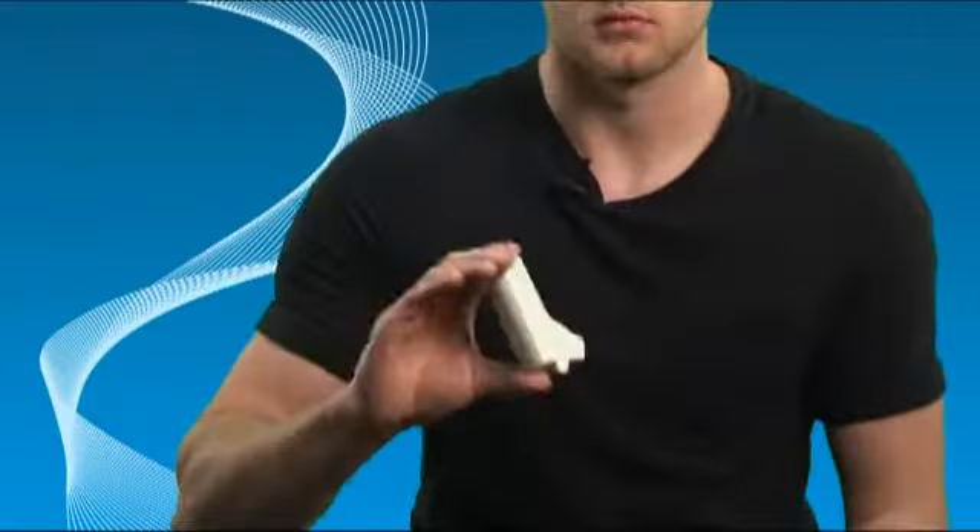How to use the Easy Breathe. Shake the inhaler. Hold the inhaler upright. Open the cap.